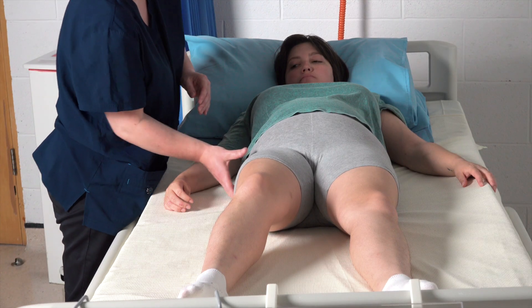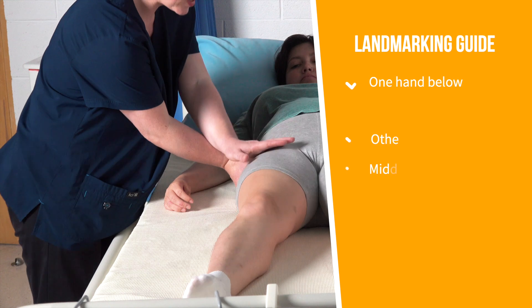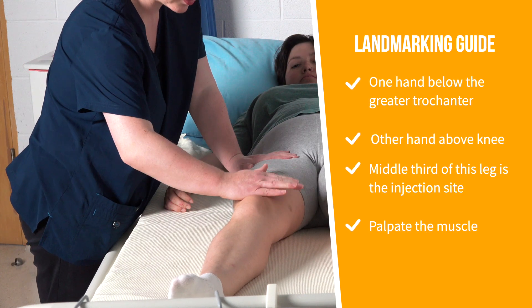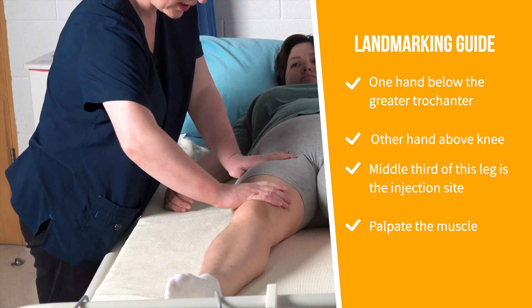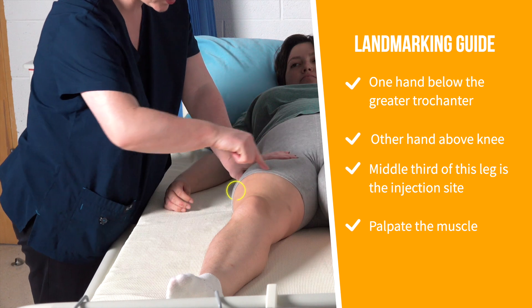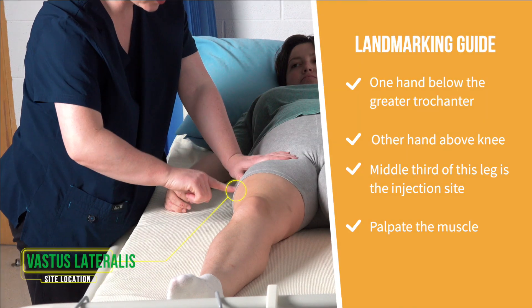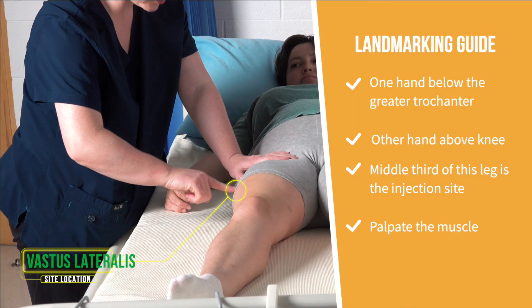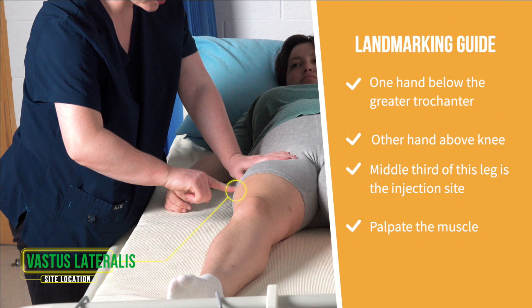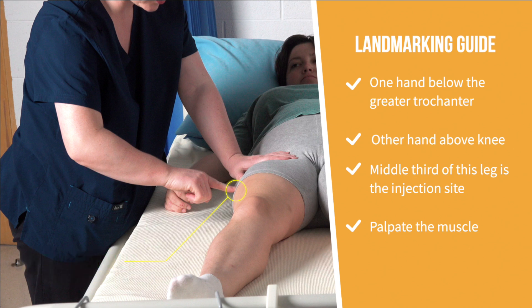To locate the injection site, identify the greater trochanter and on the anterior lateral thigh place one hand below the greater trochanter and place another hand above the knee. The middle third of this area is the target, spanning from the midline of the thigh to its outer edge. Palpate the muscle.